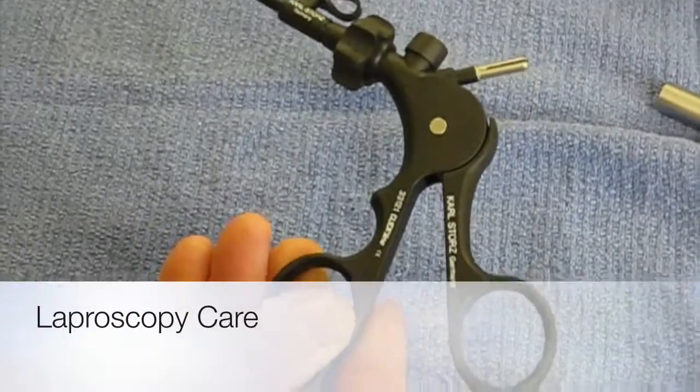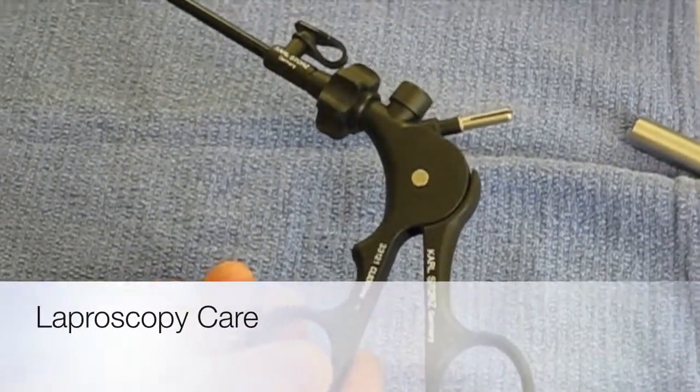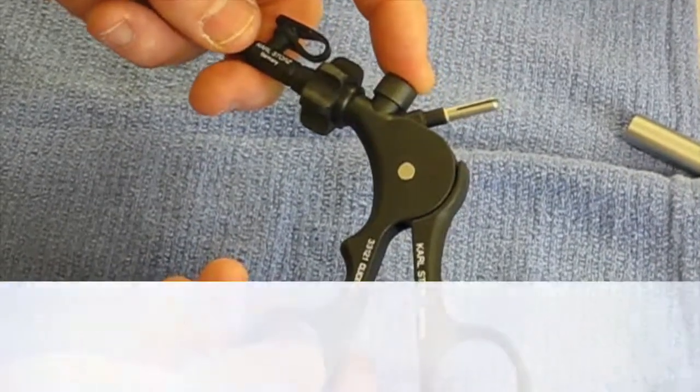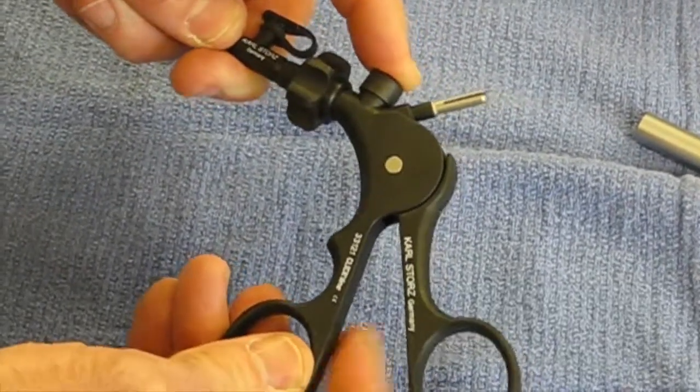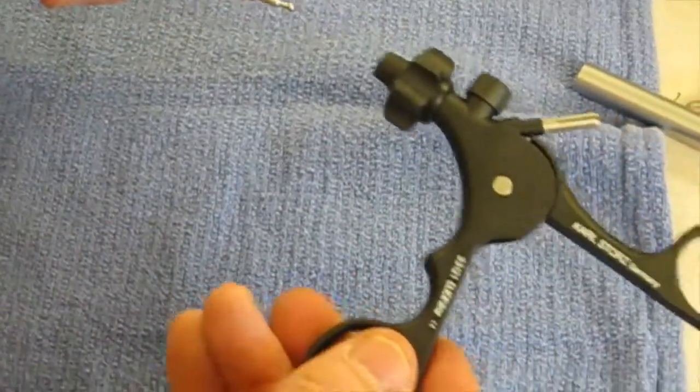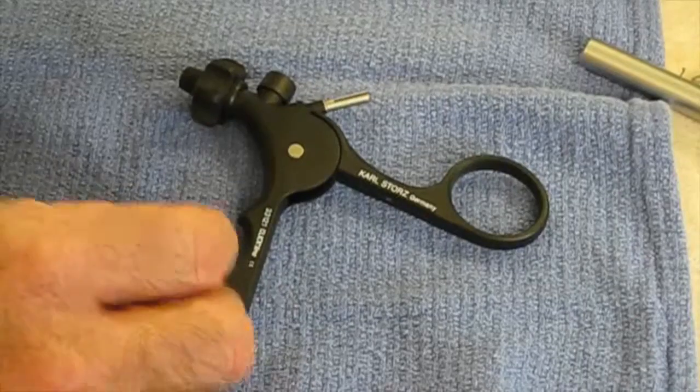Okay, for proper cleaning of the click line instruments, laparoscopic instruments, what you want to do is disassemble it into three parts. If I push this button and open the handle, that allows me to remove the handle, and you can soak that in enzymatic cleaner.